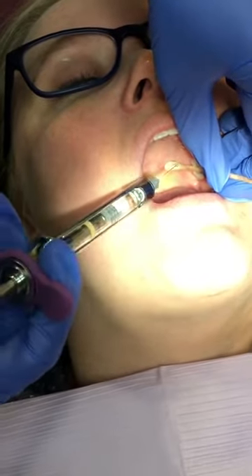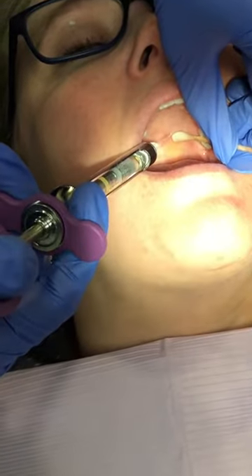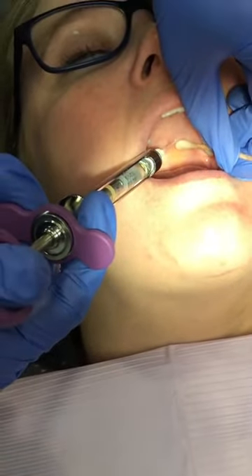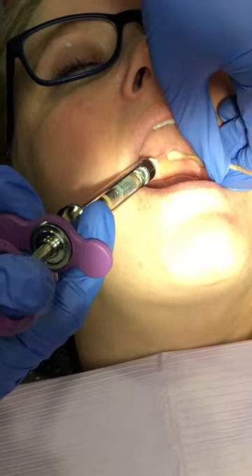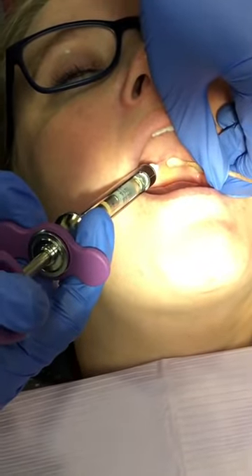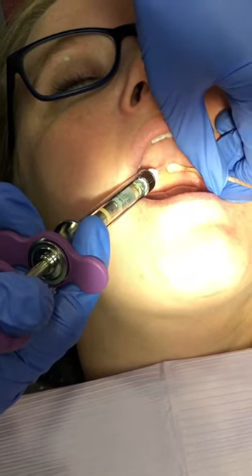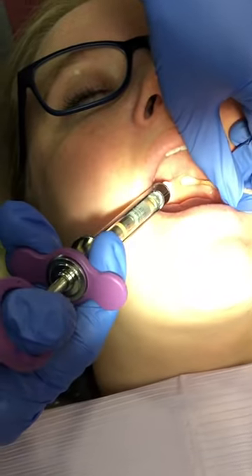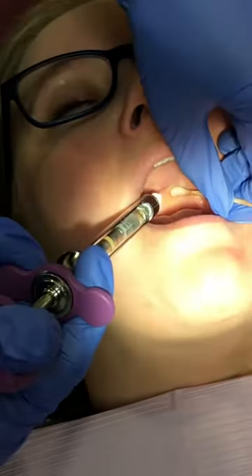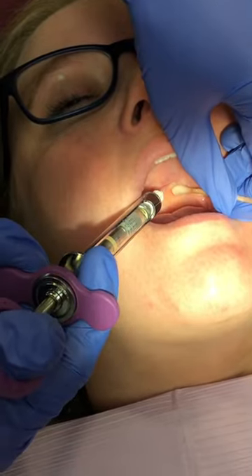I'm going to hold it while I slightly move away. Insertion, deposition — no aspiration. Deposit as I'm slowly moving away, and withdraw.